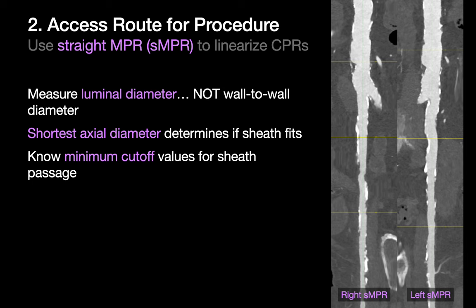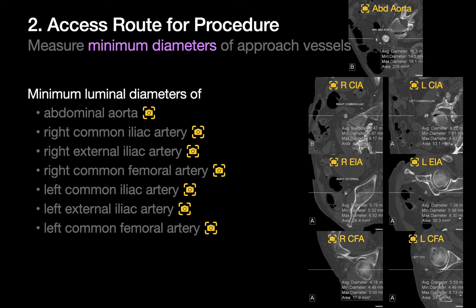A 5mm sheath may not fit in the lumen of a 6.5mm mean diameter vessel if the lumen is 2mm in one dimension and 11mm in the other. Be particularly meticulous when you're measuring diameters that are near known cutoff values. Using the straight MPRs, you will identify, measure, and report the minimum short-axis luminal diameters of the abdominal aorta and the common iliac, external iliac, and common femoral arteries on both sides. Remember to use the epigastric artery as your boundary between the external iliac and common femoral arteries, and do a short-axis image capture of each of these seven vessel sites.